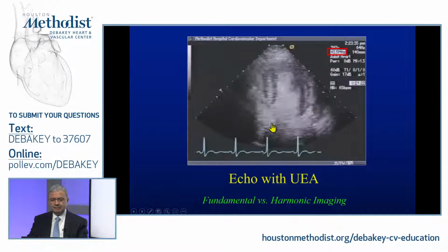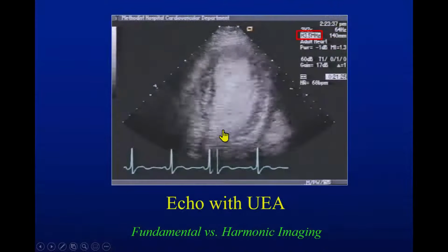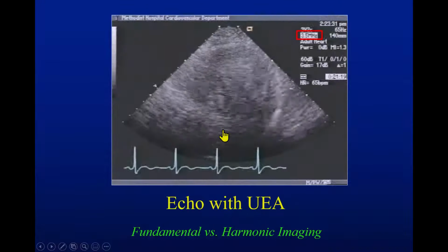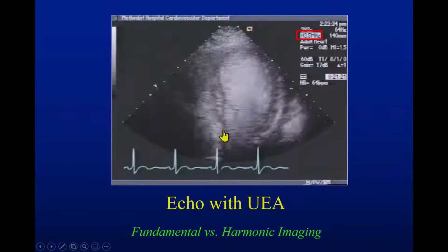Harmonic on, and harmonic off. Harmonic off, harmonic on.